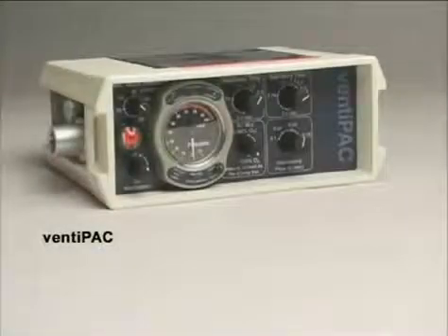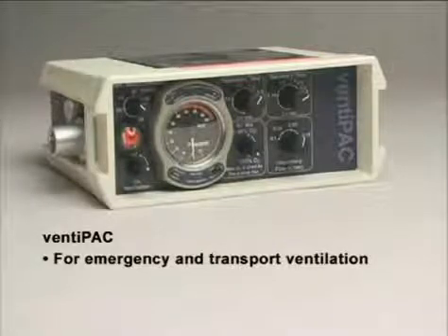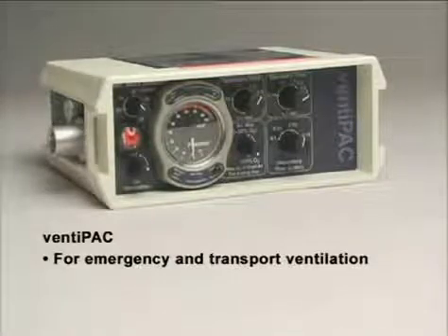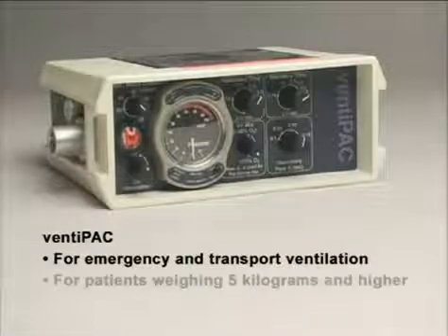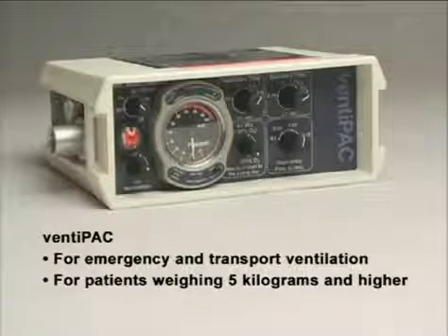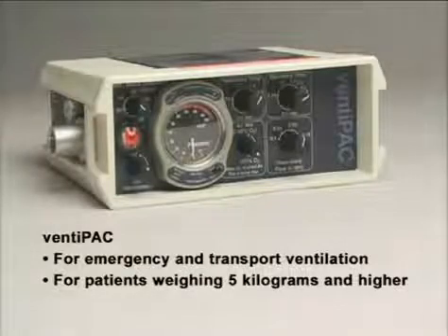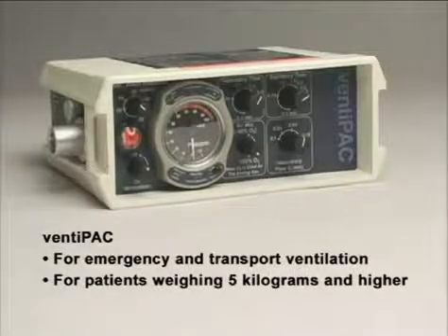The ventiPAC is an extremely durable, easy-to-use ventilator for emergency and transport ventilation, both outside and inside the hospital. It provides clinicians and trained emergency personnel with greater control of breathing parameters for a patient population weighing 5 kilograms and higher. This unit offers an extensive array of features and controls designed to help you provide the ventilation expertise your patients require. To optimize use of this unit, familiarize yourself with the following features and controls.